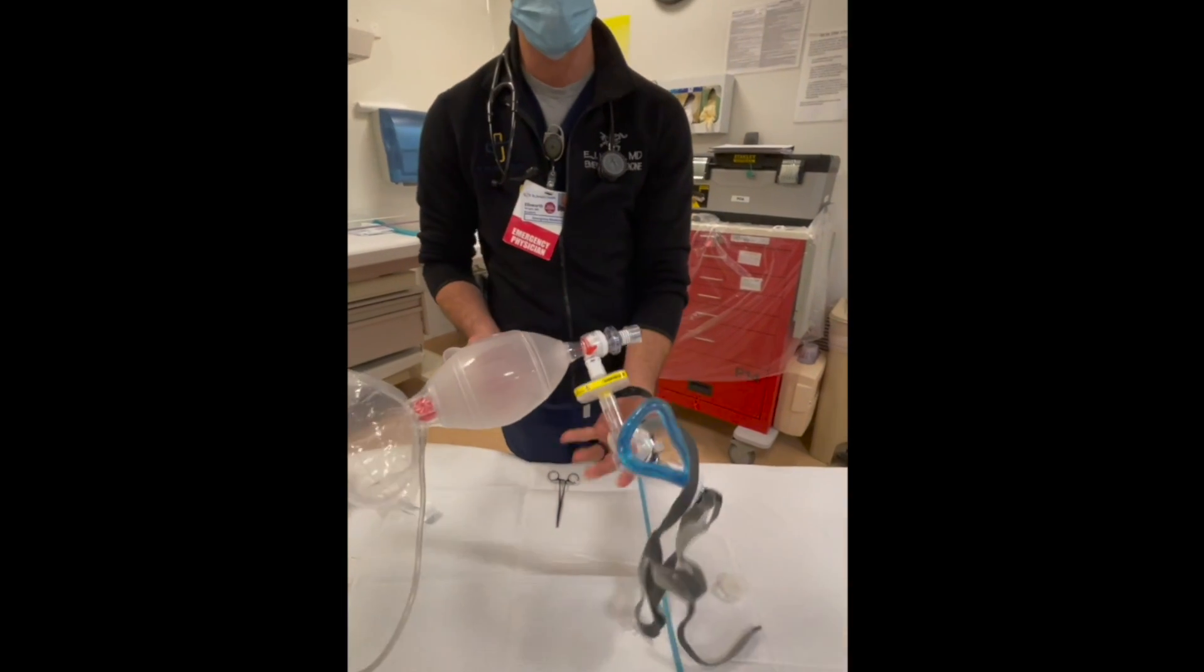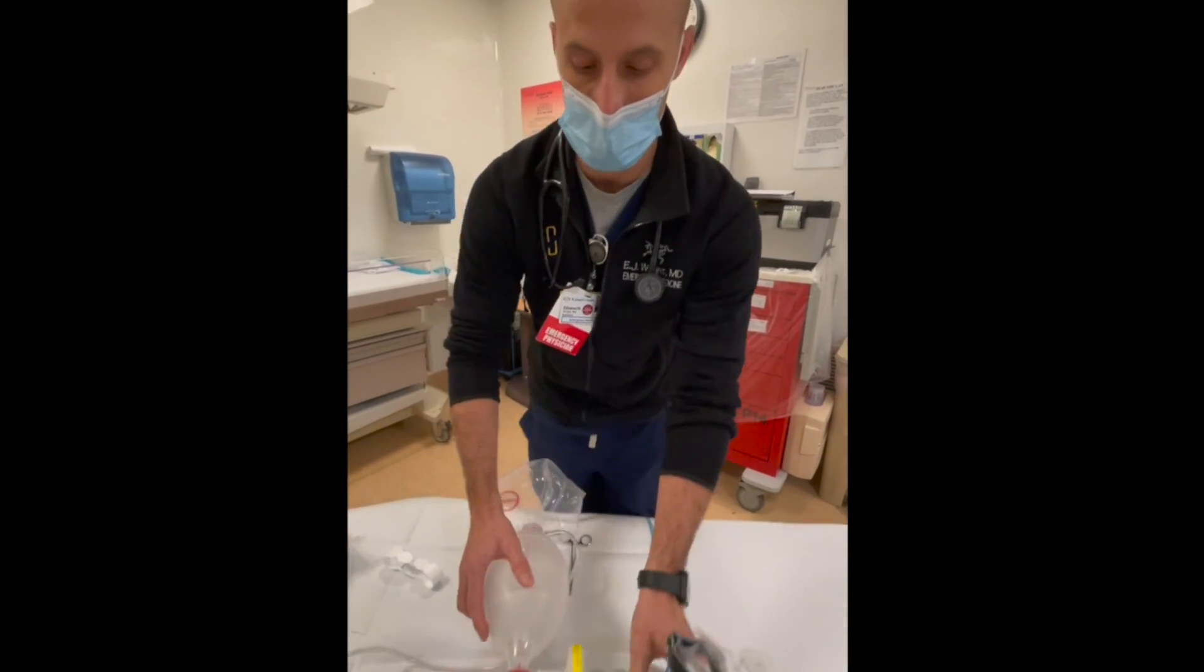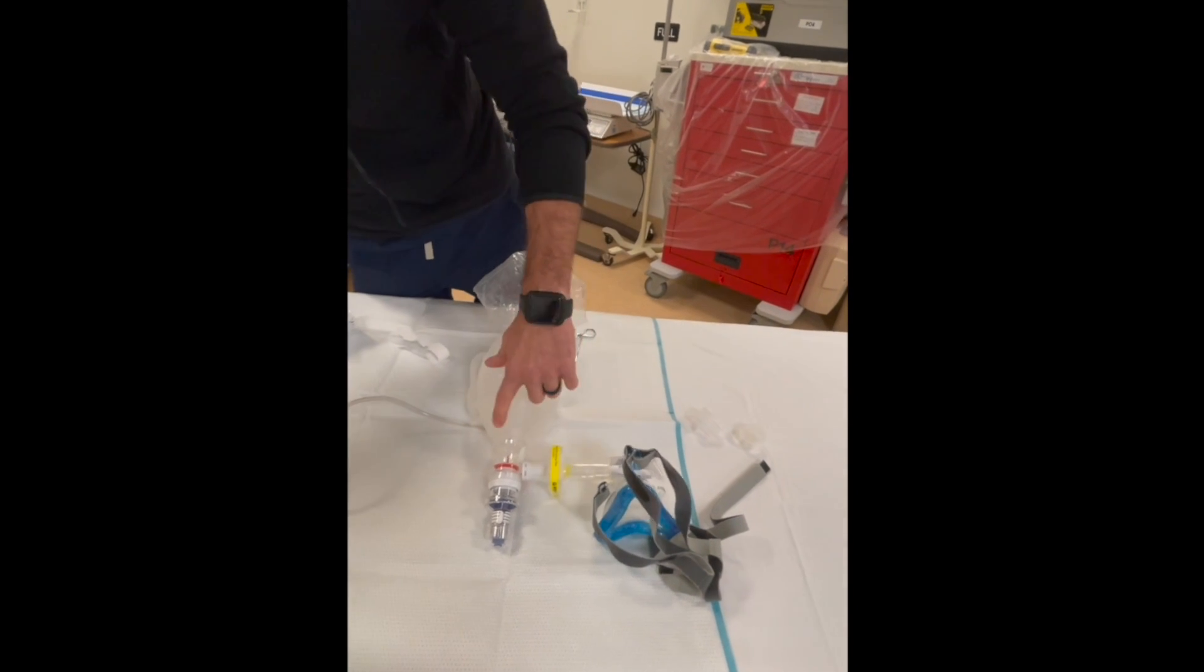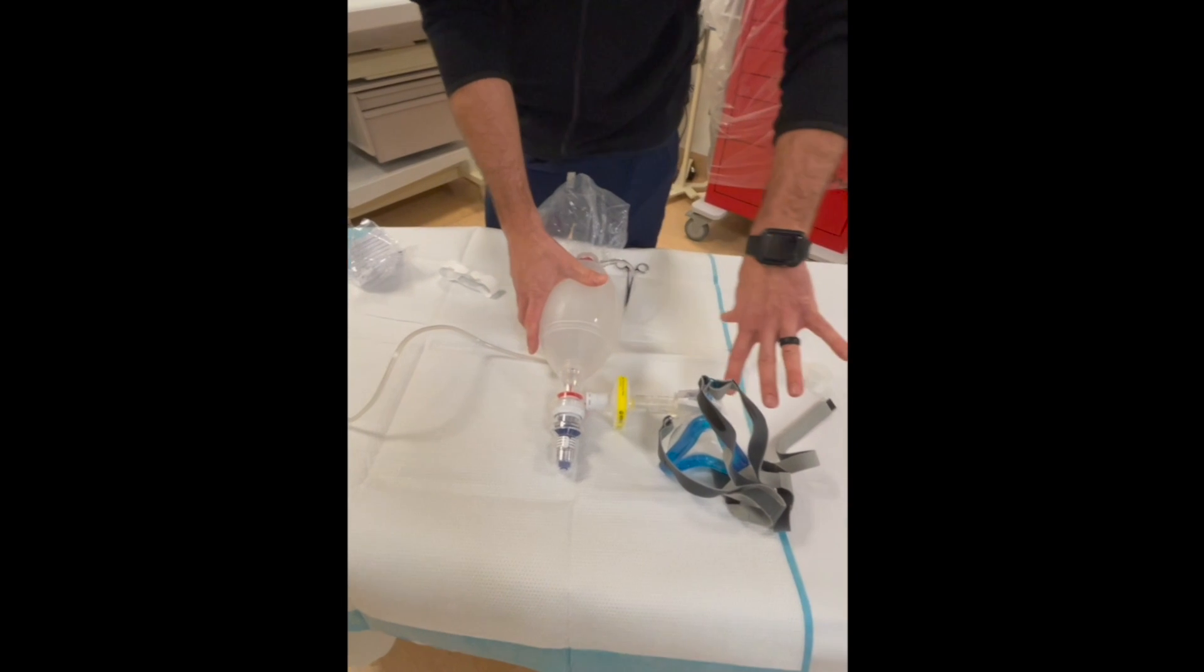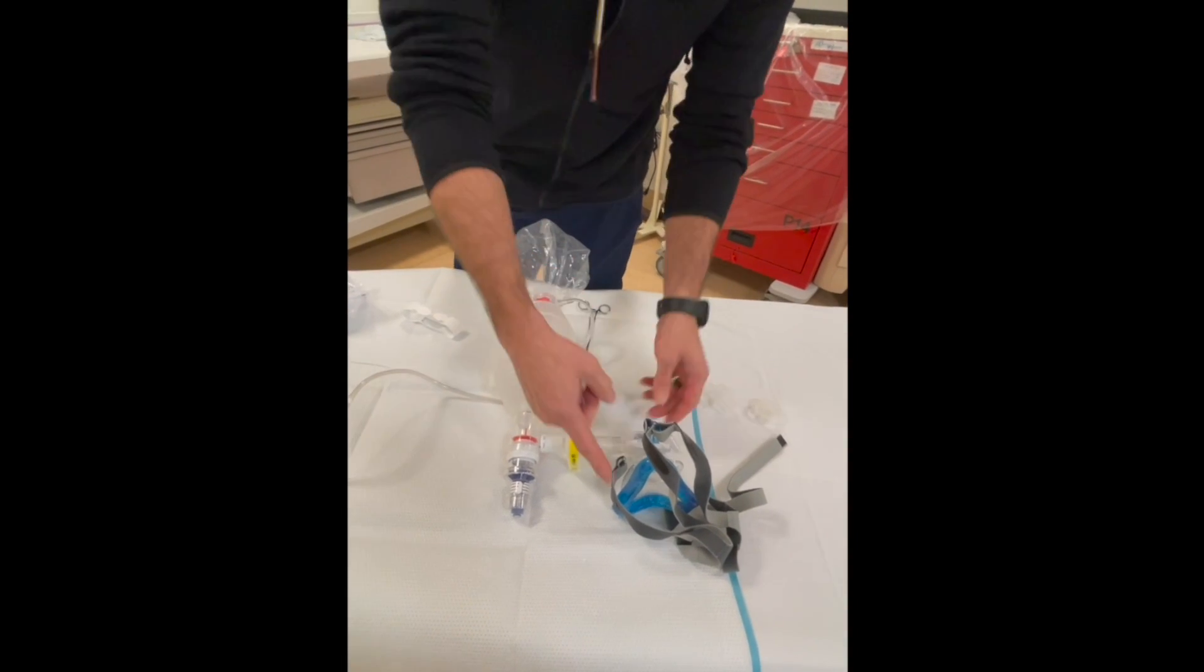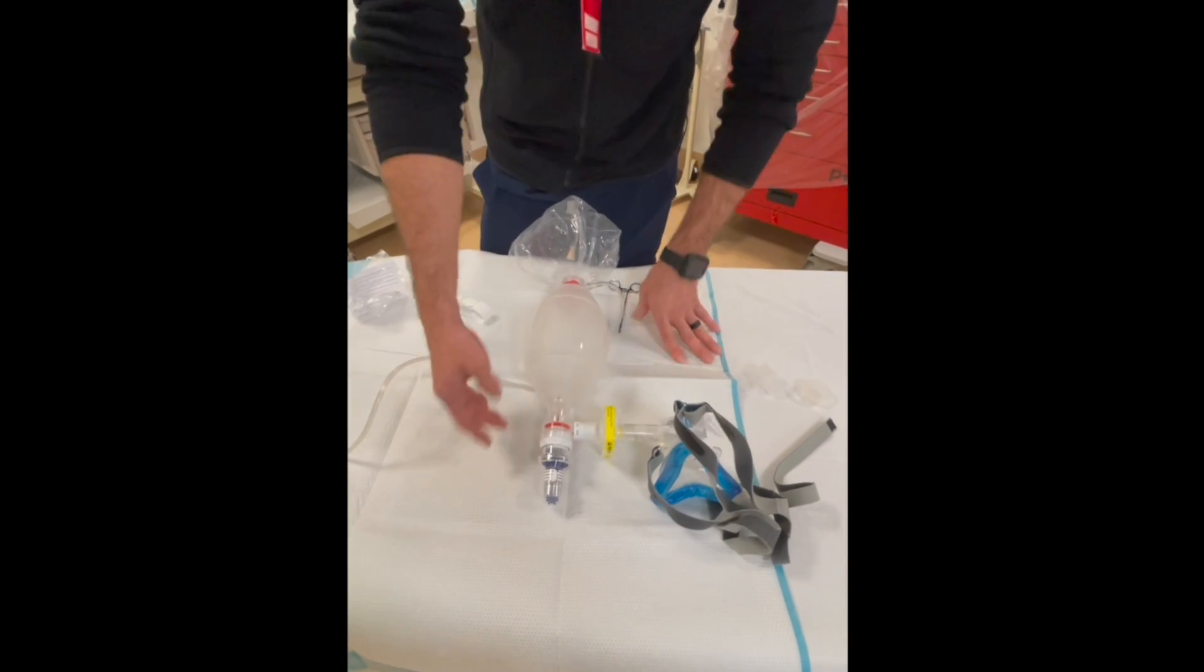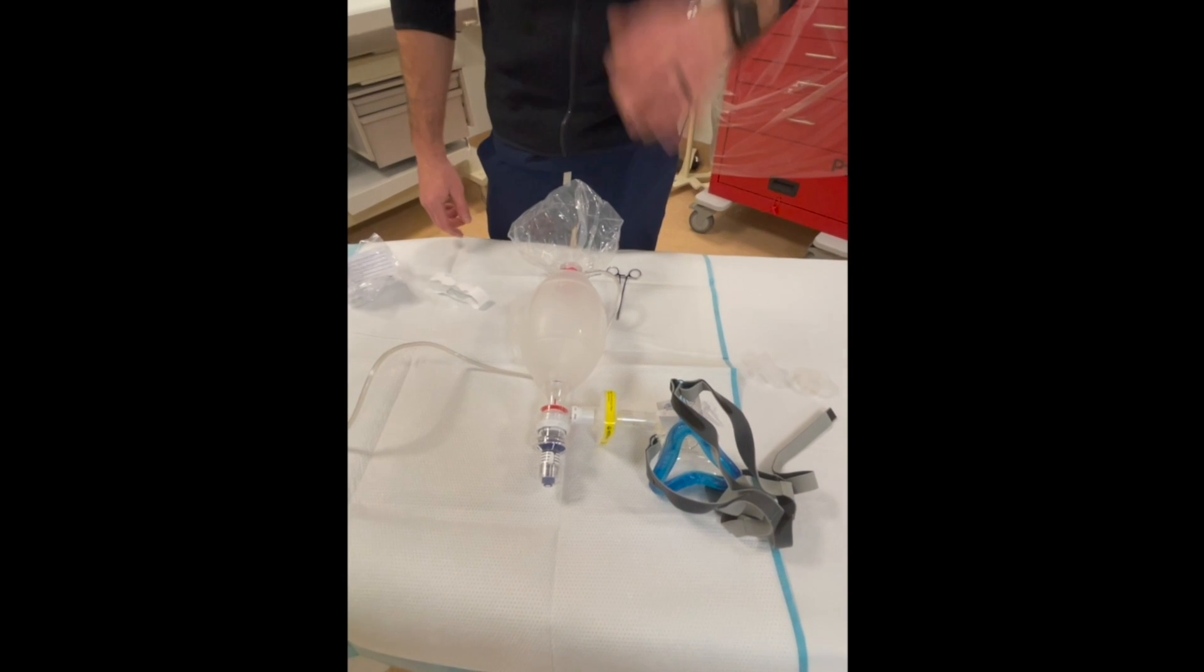When the patient breathes, they are going to inhale the oxygen which is coming in through our reservoir, which is going to provide our increased mean airway pressure. When they exhale, they're going to exhale through this tube and it's going to go out the PEEP valve. This is how they develop the actual end expiratory pressure, and again this is going to be adjustable.